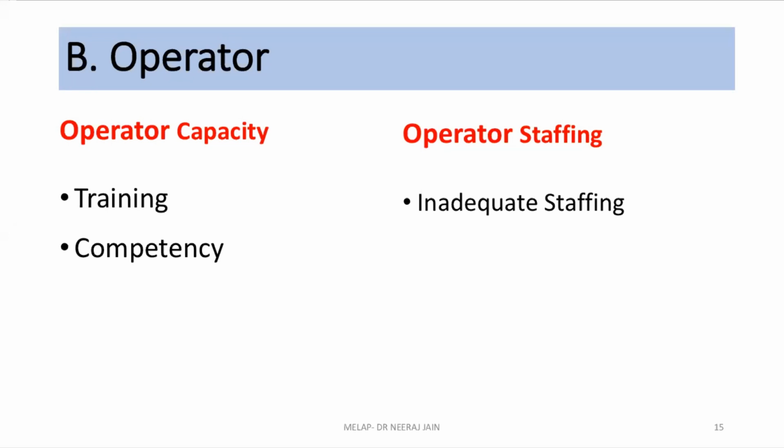Then you shall have the ability to use acquired knowledge and skill in the practical situation, whatever you are teaching them. This shall be properly mixed. How should the prothrombin time tube be mixed, how should the EDTA sample be mixed, not too vigorously, not too lightly. Otherwise some minor clots come up. Staff should be adequate.